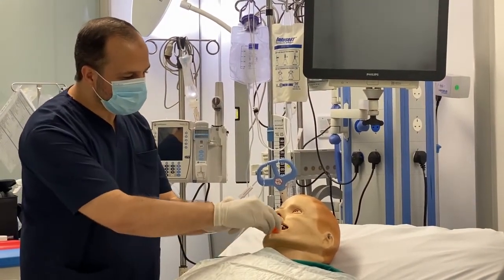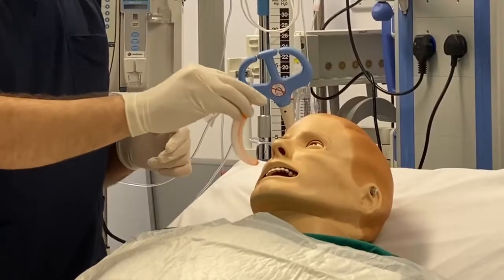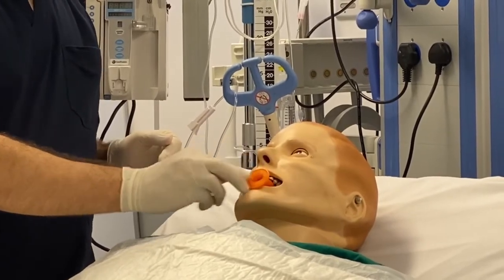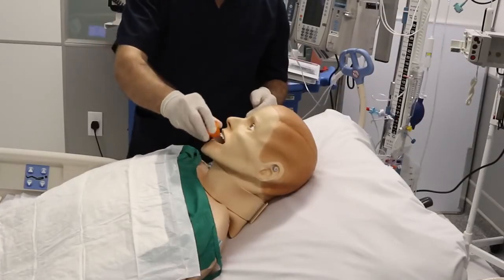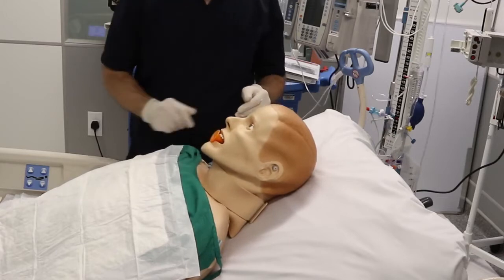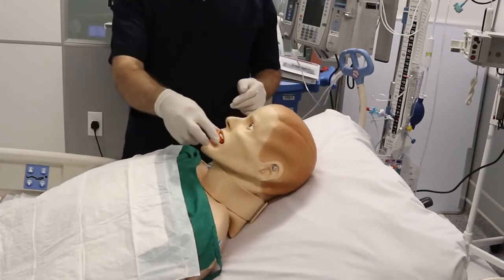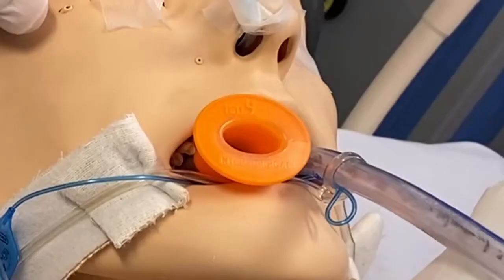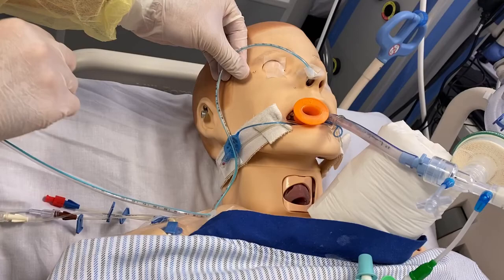The second method, which is the most common, involves inserting the oropharyngeal airway in the opposite placement — inverted. Then, as the tip reaches the posterior wall of the pharynx, rotate the oropharyngeal airway 180 degrees while advancing it into the proper position. Make sure the flange is stable and positioned securely on the patient's lips.